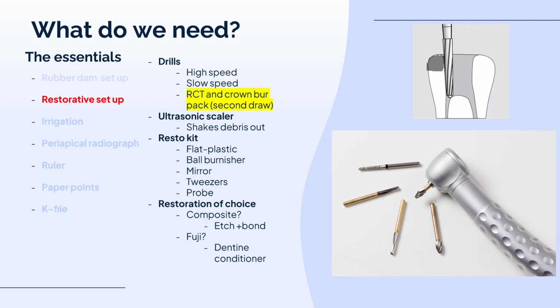So I've got long drills, and I've got this special drill bit here. It's called the Endo Z burr. It's a gold shanked burr. I think I talk about it in the next slide. But that's in my pack. But yeah, I encourage dentists to make their own packs.